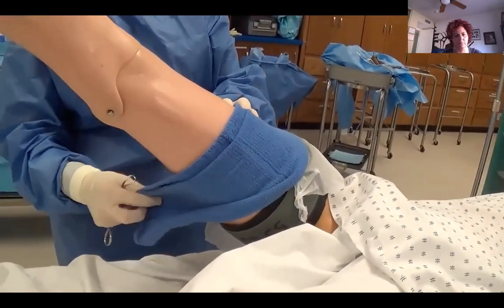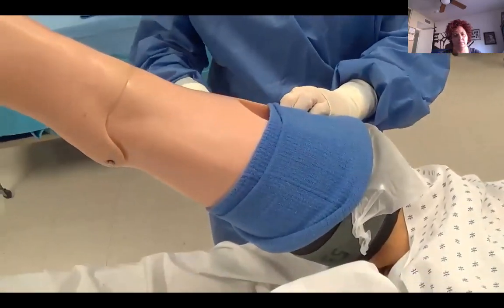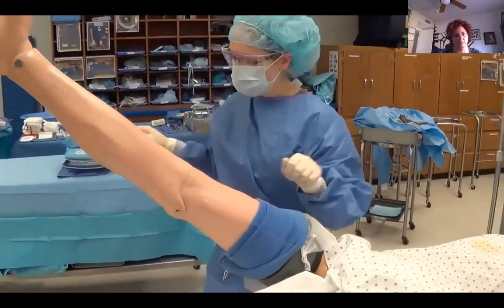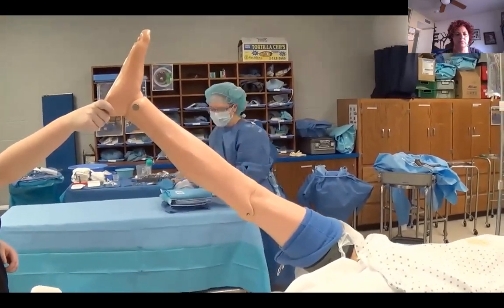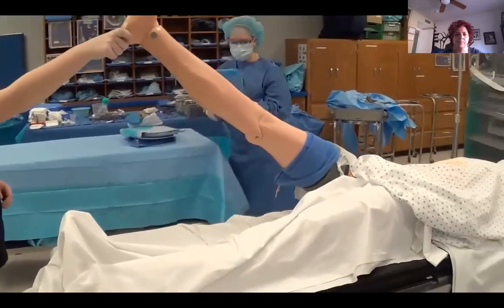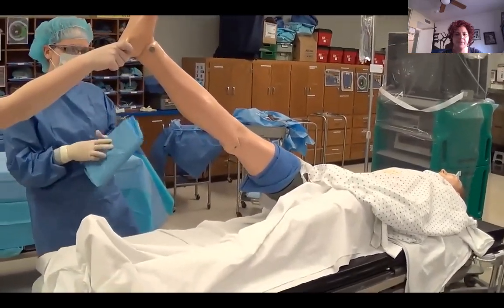And then we come around and we're going to secure that with a perforating towel clip. There may be other ways to fold this depending on your surgeon's preference as well. Some docs may open it kind of like the triangle towel that we apply for the lithotomy draping and then secure that. And some surgeons don't use it at all, but it's just going to be whatever their preference is. Okay? So you may have something that's placed prior to the application of the impervious split sheet.